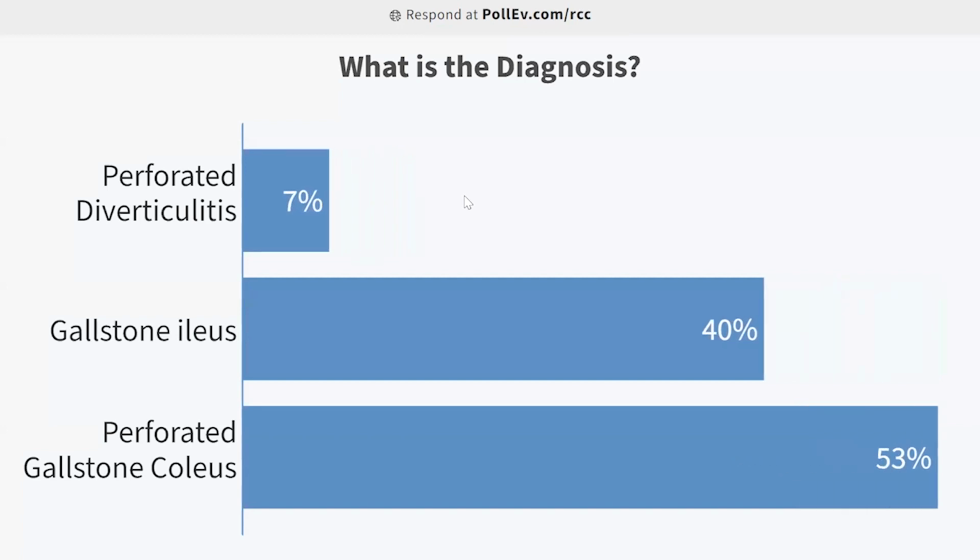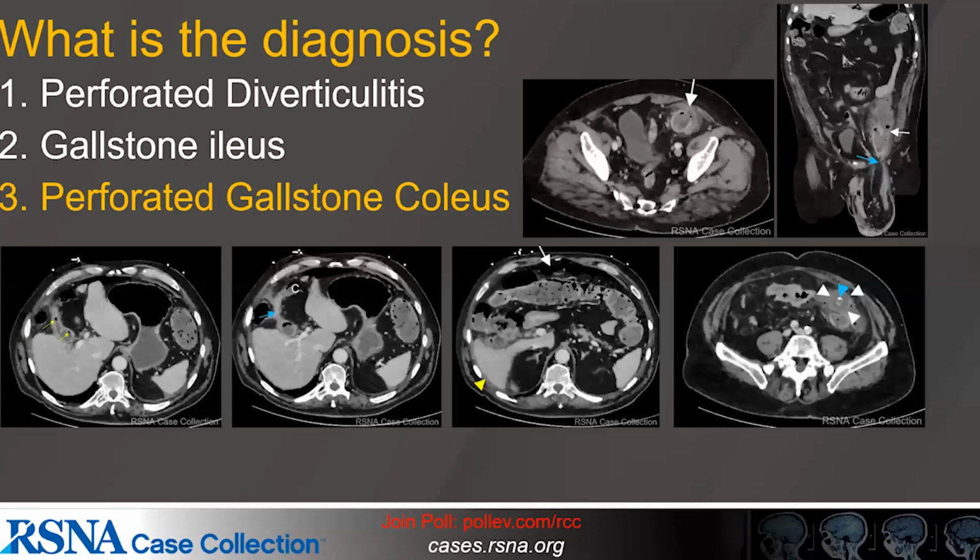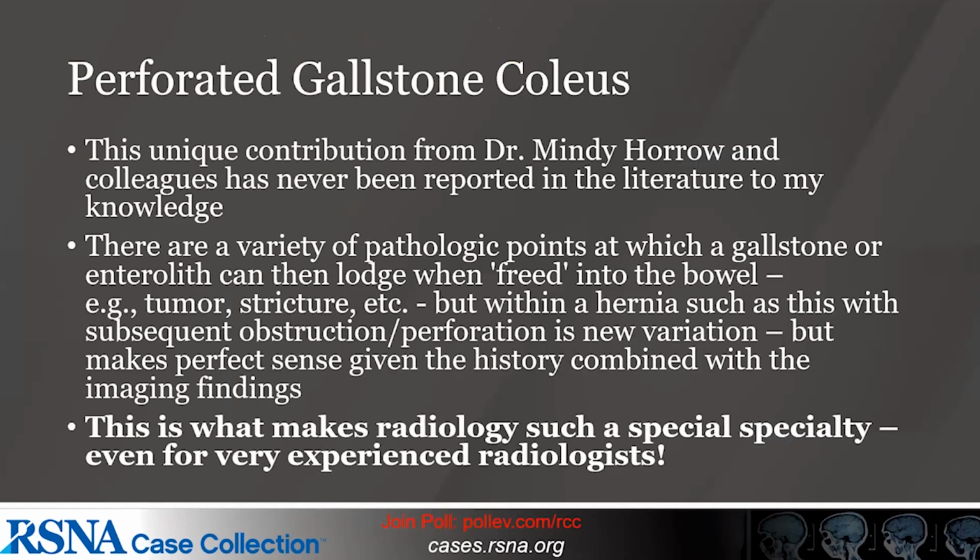Okay. So again, we want the most specific answer here. Wait another minute. Okay. All right, let's go on to the answer slide. Next slide, please. And in fact, this is something, again, the authors are coining this term for the first time ever to my knowledge, perforated gallstone coleus. Let's go on to the discussion slide, or there's the diagnosis.